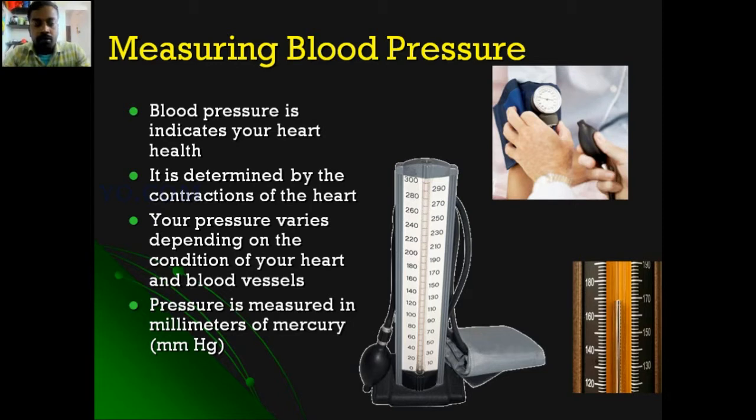In this session we are going to study blood pressure measurement. In the last session we studied temperature measurement, but here we are going to study blood pressure measurement.